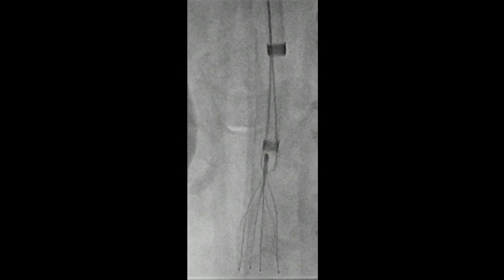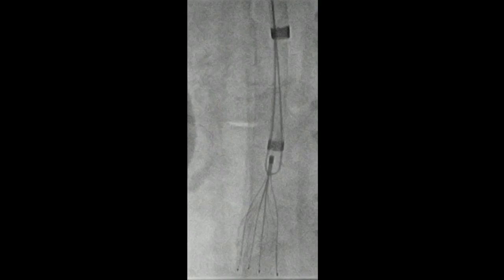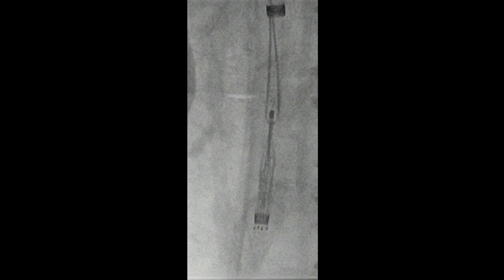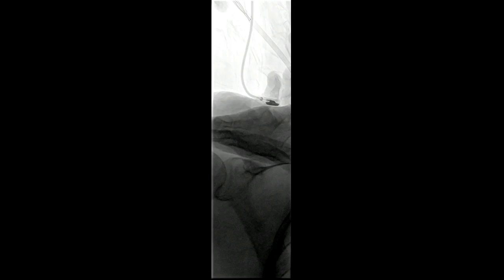It looks pretty promising here, and for the snare — it was outside, now it's in, so we don't even need to bother with the snare. Looking at this in multiple different directions, with tension on the loop you can see that we've almost got it, and it's going to pop off the wall. This is always kind of a bit of a gut check when you're doing this — and you'll see it pop off the wall. Having access from below in these difficult retrievals allows you to do a cavagram almost immediately and see if there's any evidence of extravasation. I've seen extravasation multiple times; in most cases it tamponades itself. You just want to make sure you don't lose that as it comes out. And there's no evidence of extravasation.